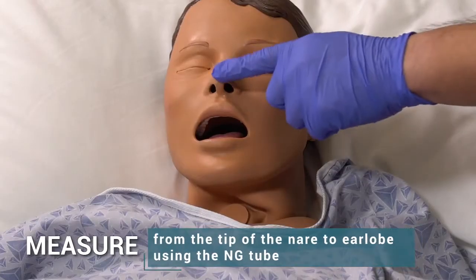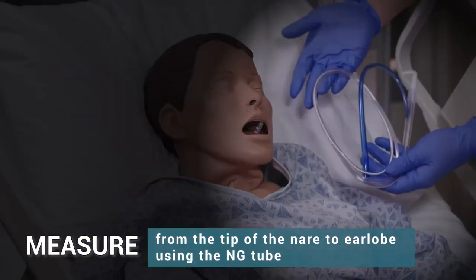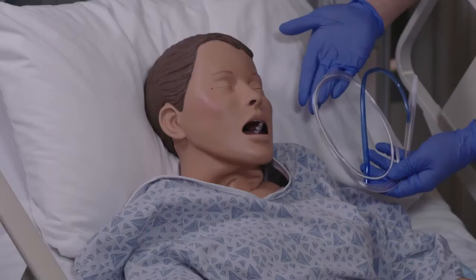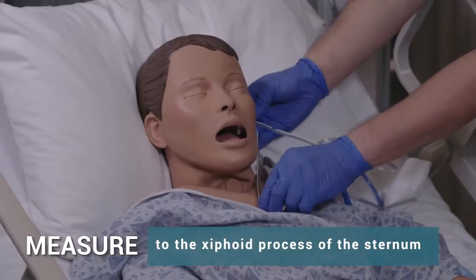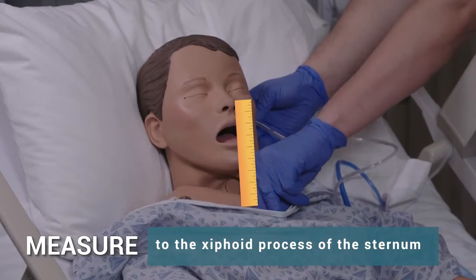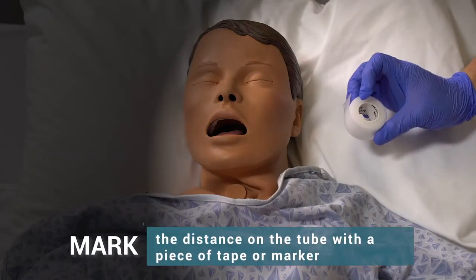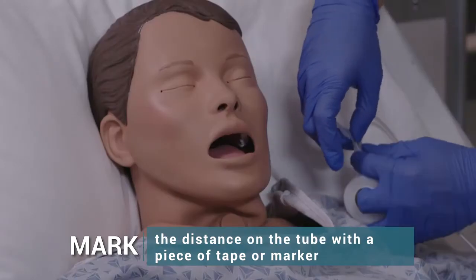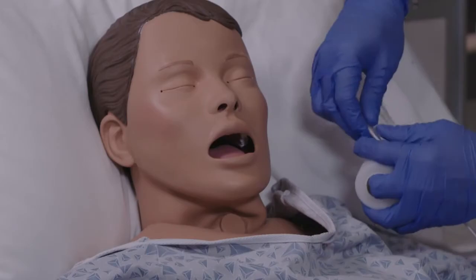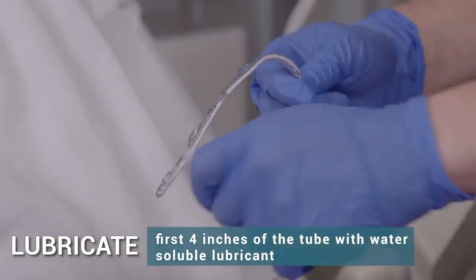Measure from the tip of the nare to the earlobe using the NG tube, then measure to the xiphoid process of the sternum. Mark the distance on the tube with a piece of tape or marker. Lubricate the first four inches of the tube with water-soluble lubricant.